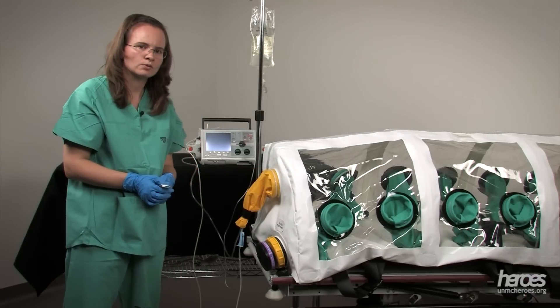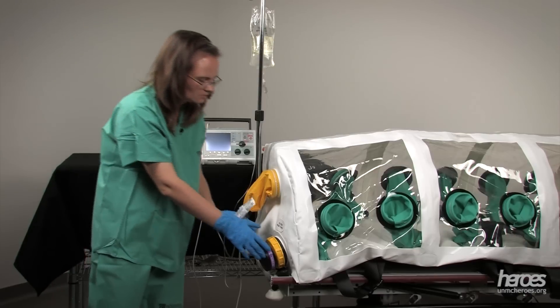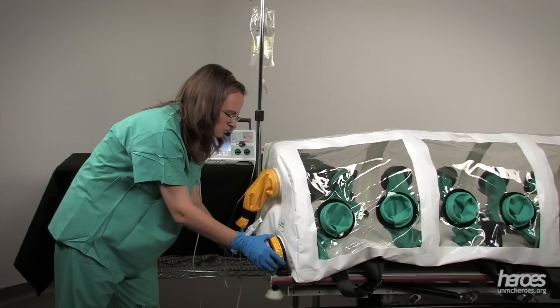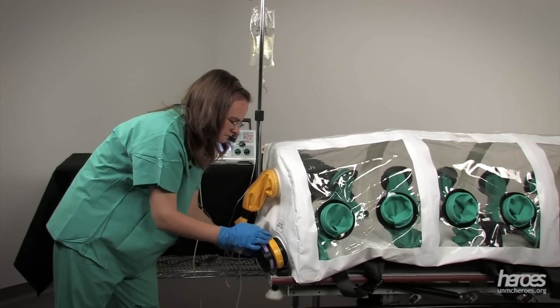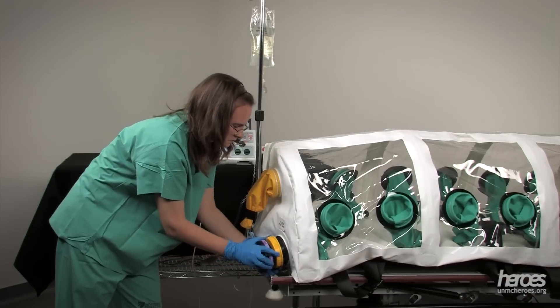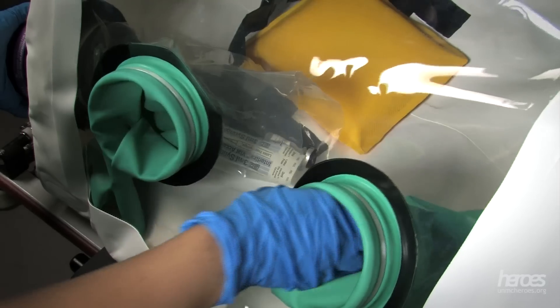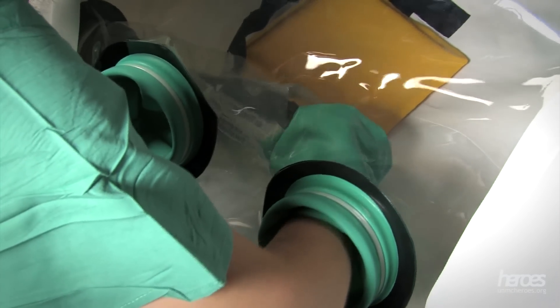There is another access port that is only available on the head end of the isopod. This is a small pass-through that is covered by a yellow cap. We can remove this cap, insert our small items, and put the cap back on. Once the items are inside, the care team can retrieve the items from the sleeve.